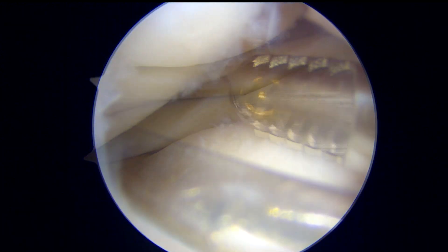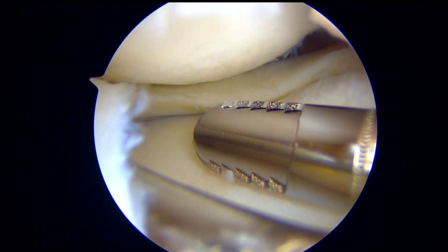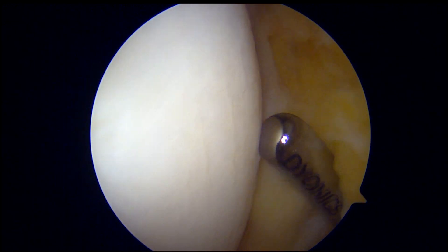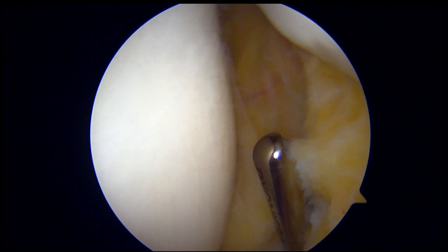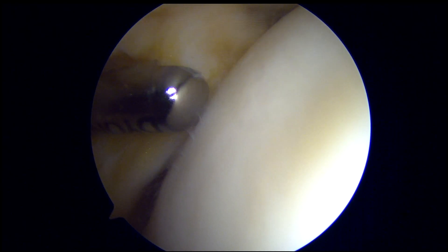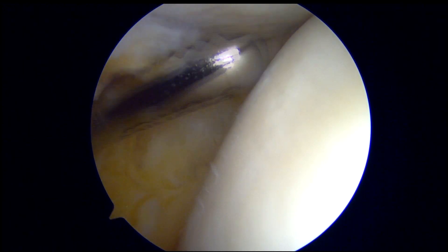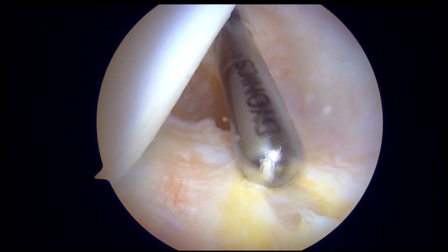We are now in the lateral compartment of the knee, and the arthroscopic shaver is utilized to remove all these loose bodies. The goals of surgical treatment for synovial chondromatosis are not only to remove the loose bodies, but also to perform an aggressive synovectomy — removing the synovial tissue throughout all compartments of the knee. By removing the synovium, the goal is to remove the disease process that causes these loose bodies.